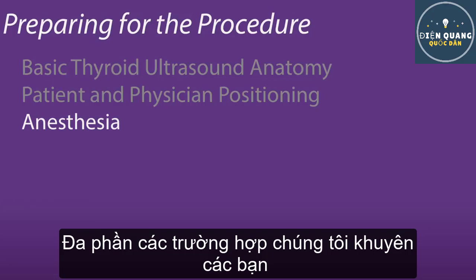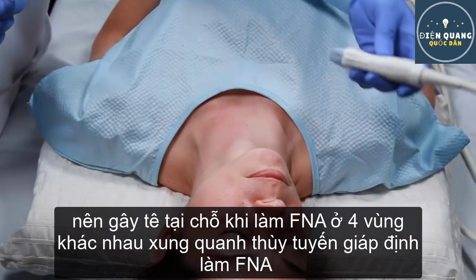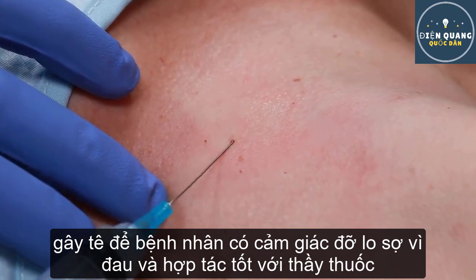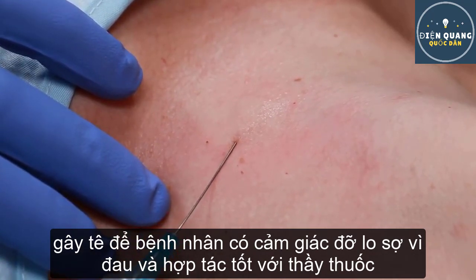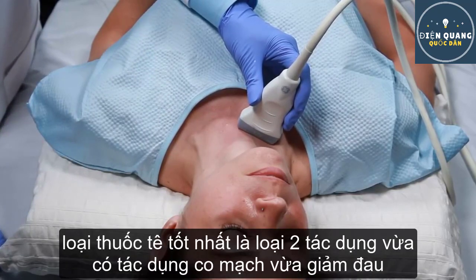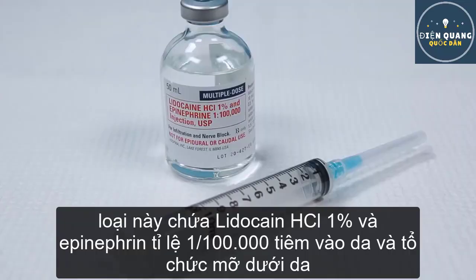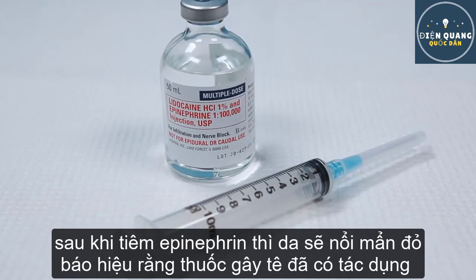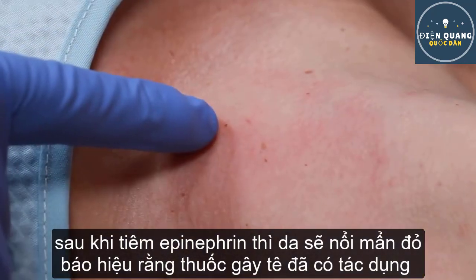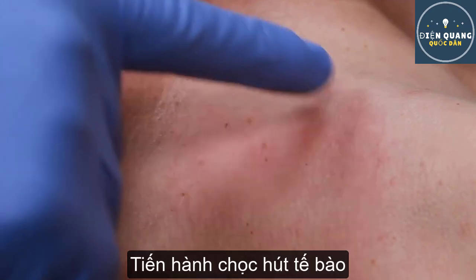Anesthesia. In most cases, we recommend local anesthesia during the FNA biopsy, as four separate passes are required for the Afirma solution. Anesthesia ensures patient comfort and, more importantly, cooperation during the procedure, increasing the likelihood of success. Both anesthesia and vasoconstriction can be achieved with 1% lidocaine hydrochloride with epinephrine solution injected into the skin and superficial subcutaneous tissue. The added epinephrine produces blanching of the skin, which allows visual confirmation of the site that is already anesthetized, essential for the subsequent passes.